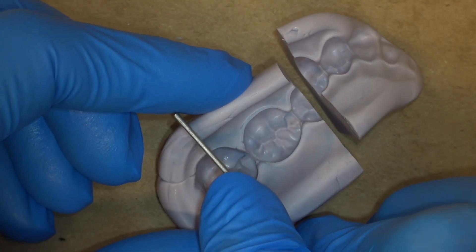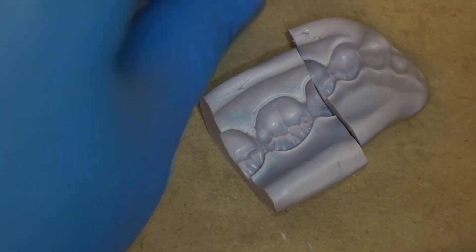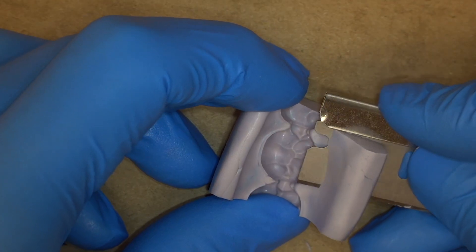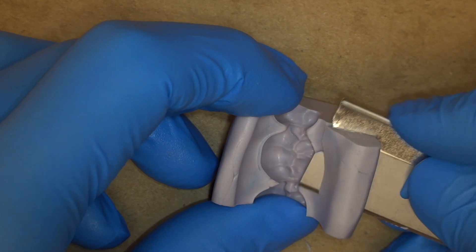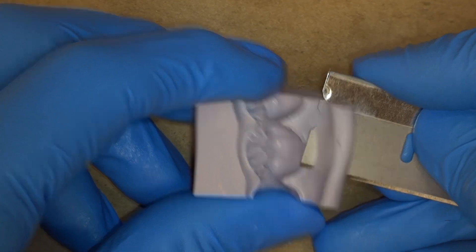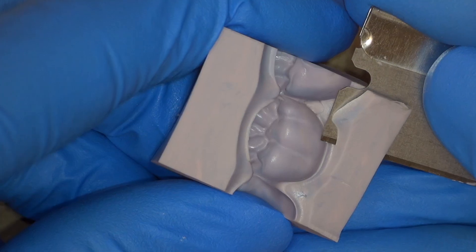Trim your putty to the halfway point on the occlusal surface of each adjacent tooth. This will allow you to verify complete seating. Having additional length of your putty extending over many teeth does not provide additional stability — in fact, it makes it more likely there will be an interference.